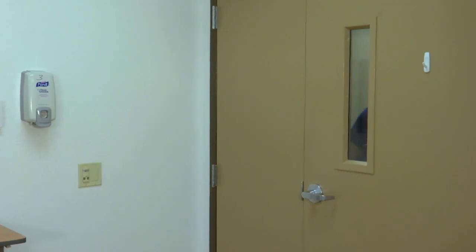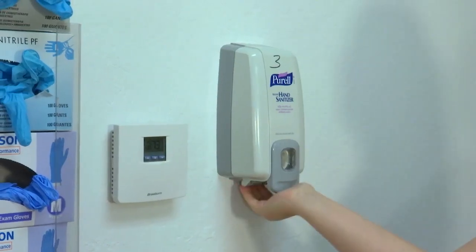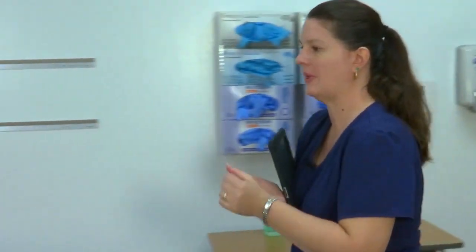Upon entering the room, provide for privacy, wash hands, introduce yourself to the patient, and explain the procedure. Good morning, Ms. Perez. My name's Christy. I'm going to be your nurse today. How are you?